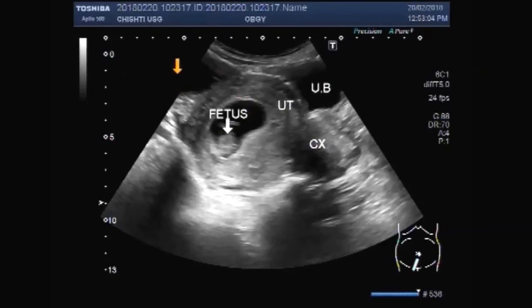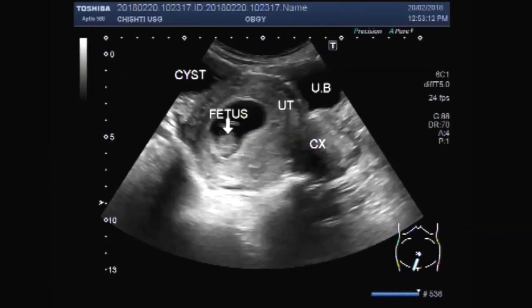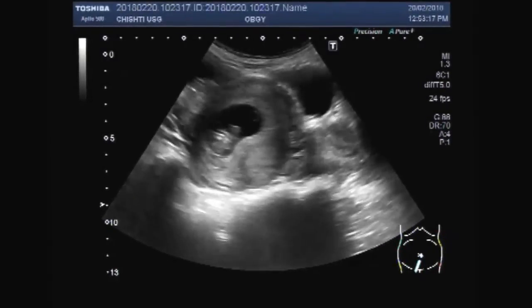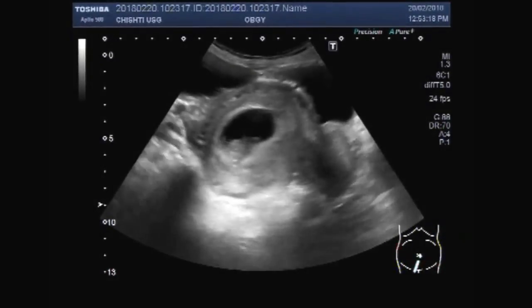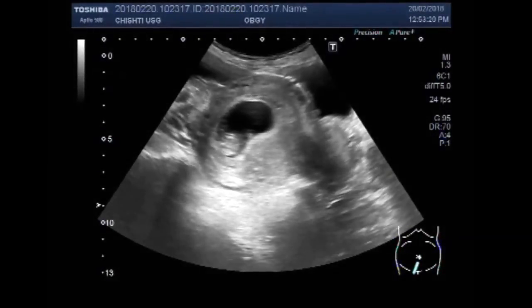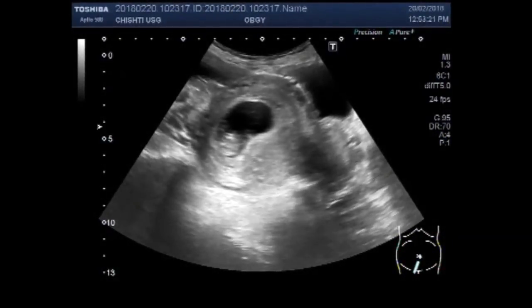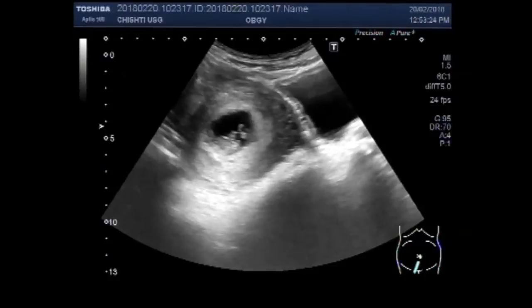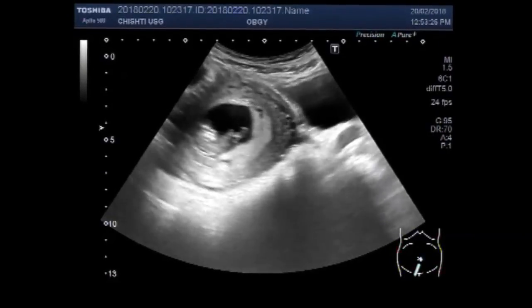And this one is a huge cyst. Now you can see the fetus with little movements.